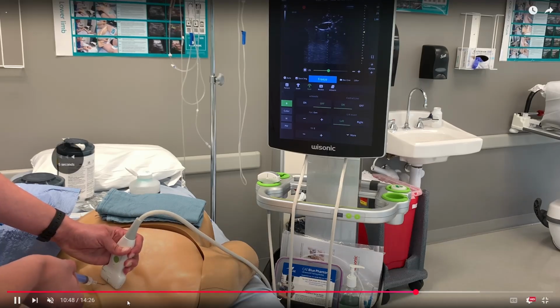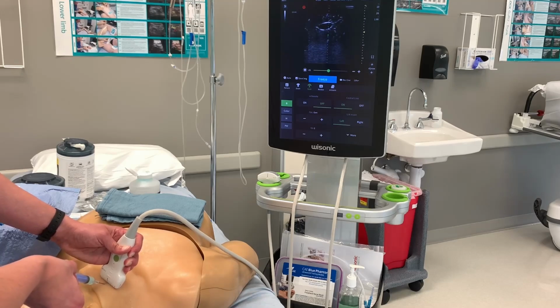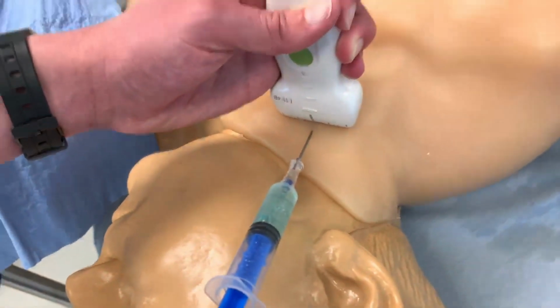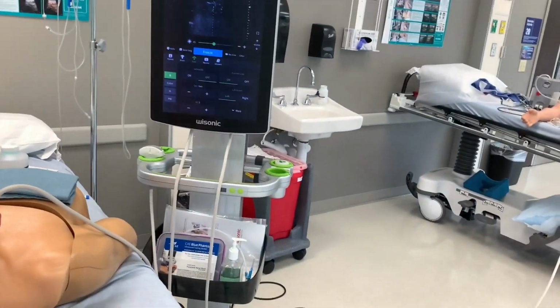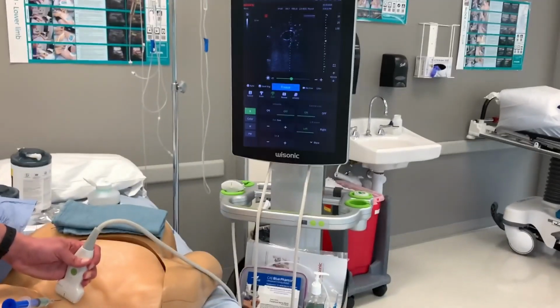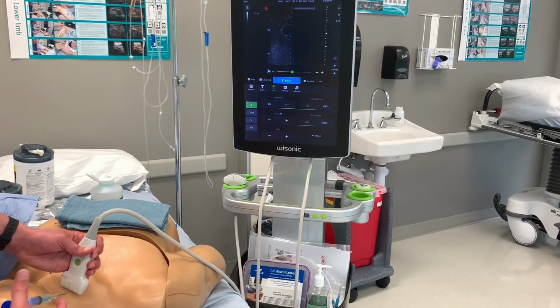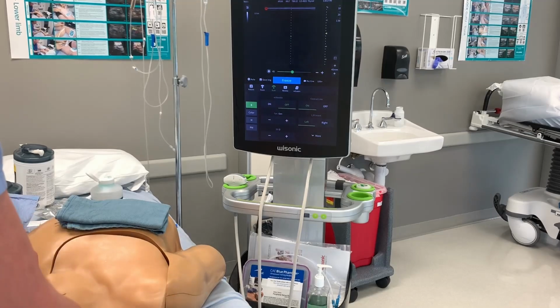If you missed it, watch. You'll notice the syringe fills with blue. And that's our simulated venous blood. And again, for theatrical purposes, I let go and give you guys a closer look. And in a real patient, no, it is not blue. I feel like that goes without saying.